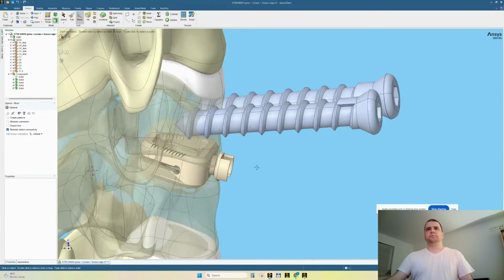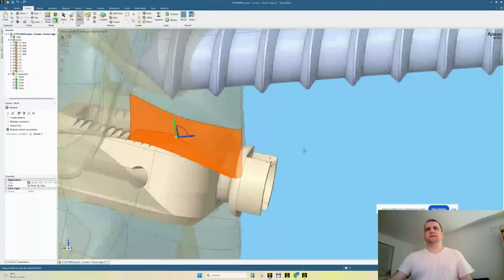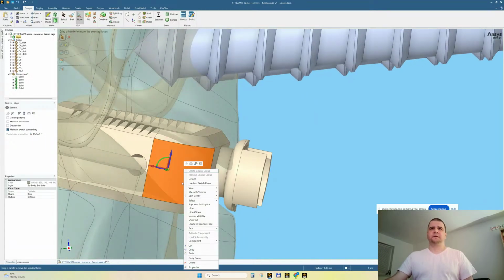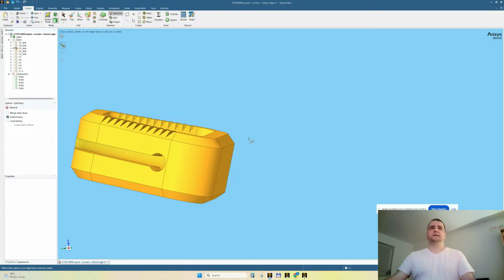This screw kind of impedes me here. The vertebrae collides with the screw. And sincerely, at this moment, I didn't plan to modify it. So for the purpose of this live stream, I will make my life easier, hide others, and cut the screw because I don't intend to modify the configuration of this part. So we don't care too much. Split body, click a target object, then the face. I will split this body and remove. Very simple.